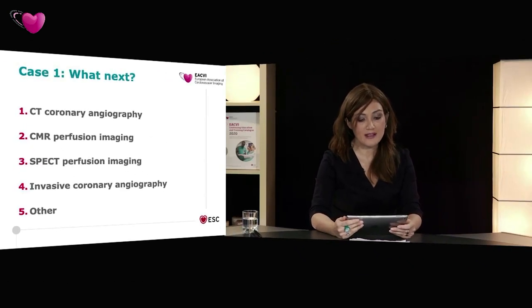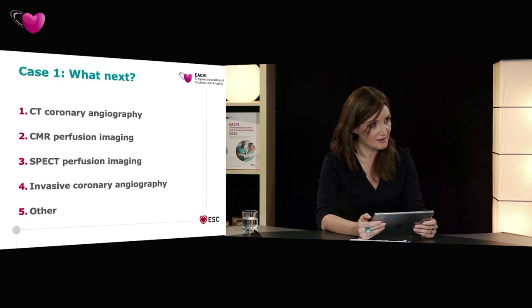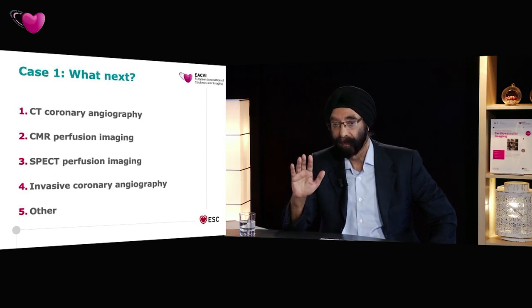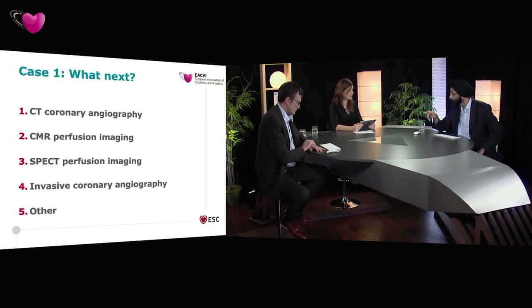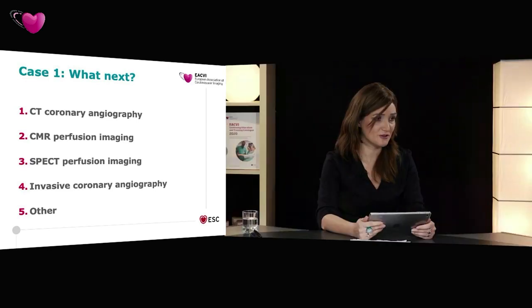What I want to ask you, as there are some questions from our viewers, can we use contrast echo with speckle tracking? So, like I said to you, I think it's very difficult. So what you can do, we have published a paper on this, is let's say that you're doing the contrast echo at rest for left ventricular opacification. You can actually get speckle tracking images when you do the high impulse flash to get rid of the contrast in the myocardium, and then use the speckle tracking to look at that darkened myocardial region. So it is possible to do it, and actually the signals are quite good. So in the context of resting contrast echo, yes, it's possible. But again, the caveats with stress are the increase of the heart rate, of course, is not doable.